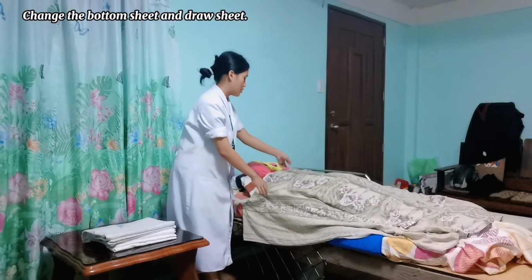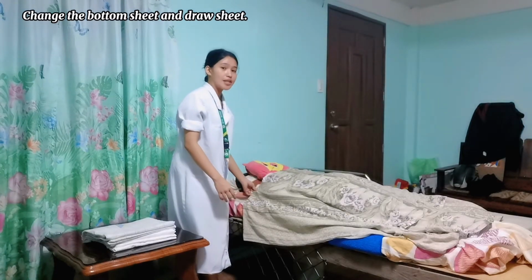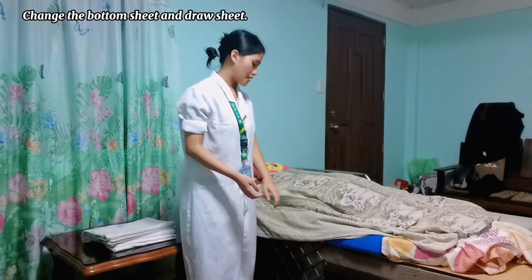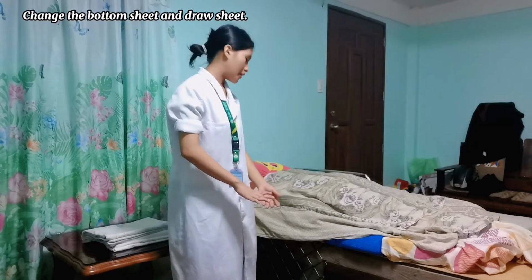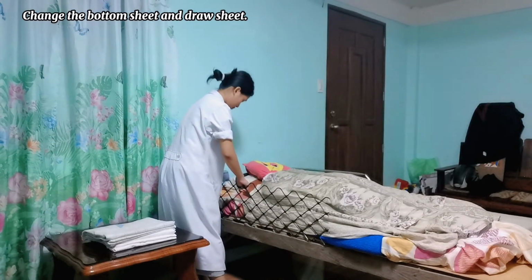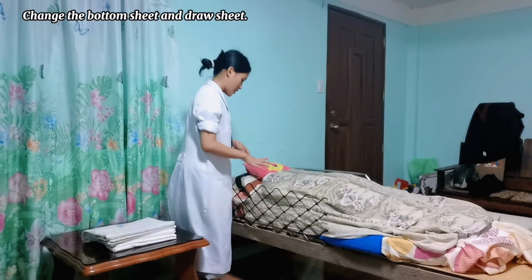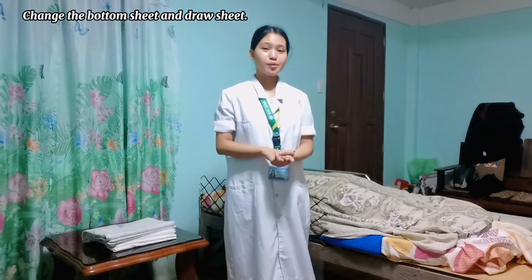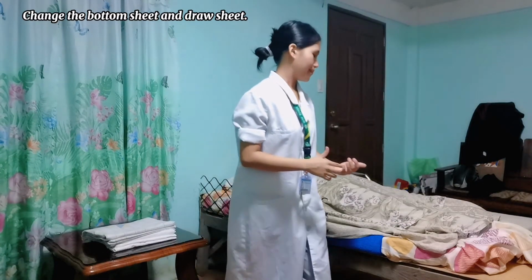Always ensure the client's privacy and dignity. And then the next one is we will be raising the side rails. This is to secure the safety of the patient. And then we will be moving to the other side.